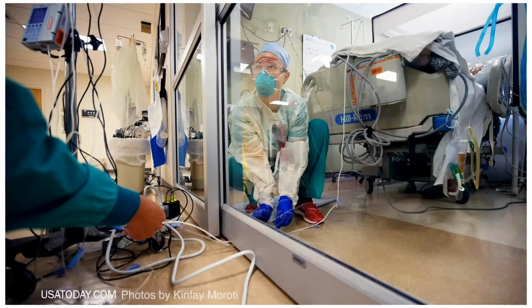So these are some images I pulled off the internet. Obviously, this first one here is pretty self-explanatory, right? They've run out of space. They don't want to go in and out of the rooms as often. So they're snaking cables underneath the door so that they can maintain the vital signs, the IV drip and things like that from outside the room. Obviously not ideal. We're going to move from a point where things are not ideal to when they're truly even more dangerous. So that's the first case.